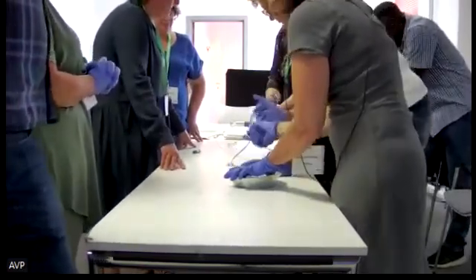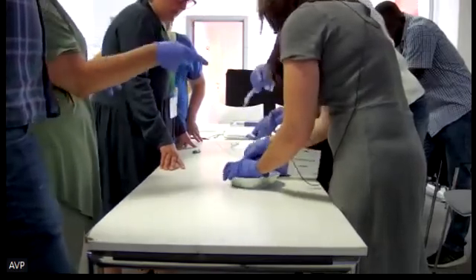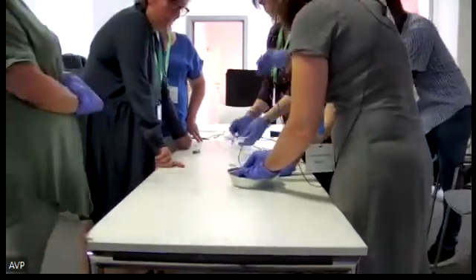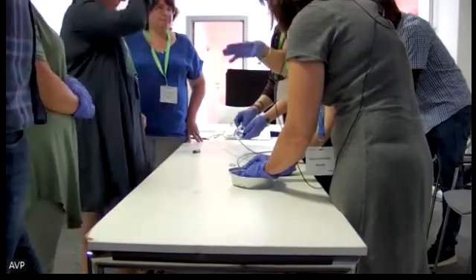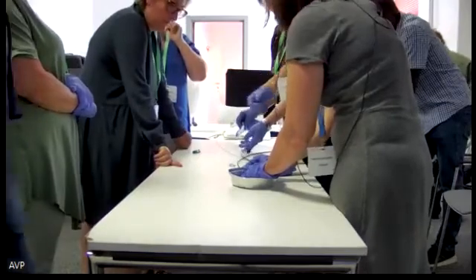I put the current and I push, and I'm inside with the cystotome. Yellow. Now if we have to put only one stent, we can remove all the system and exchange. If we want to put two stents, or a catheter and a stent, we have to double the guide wire.